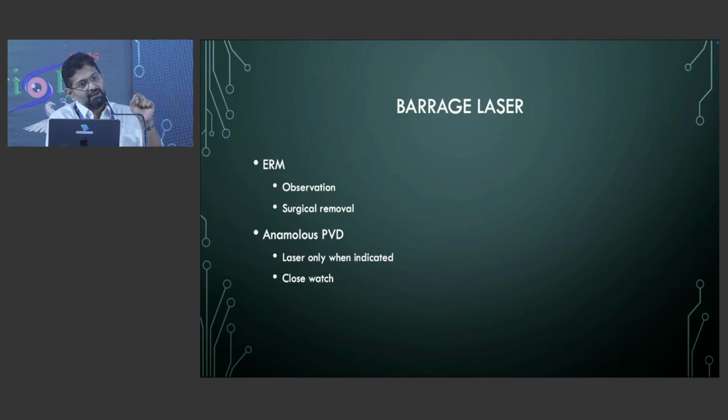So when you see a cataract surgery patient or any LASIK patient with peripheral retinal conditions, you have to treat it. Like LASIK, when you do the LASIK, Shishir just told, when we keep the suction, there is a theoretical chance that the PVD might evolve. Especially if you look at PRKs, we don't do any suction. So if you ask me, there's no need for peripheral lasers, but prophylactic lasers in such conditions.